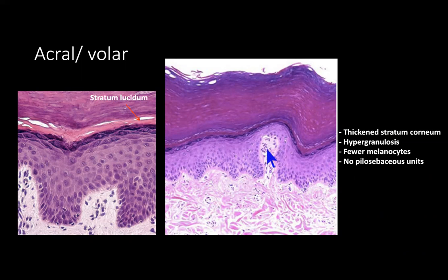cold, extreme cold, where people are getting inflammation after constriction of the vessels. And it can be seen in a variety of autoimmune diseases as well. And then there are some infectious diseases such as COVID-19, which has actually produced a pernio-like presentation, especially even in young kids. So just keep in mind that it's helpful to be able to recognize what site of skin you are on when you are looking at dermatopathology.